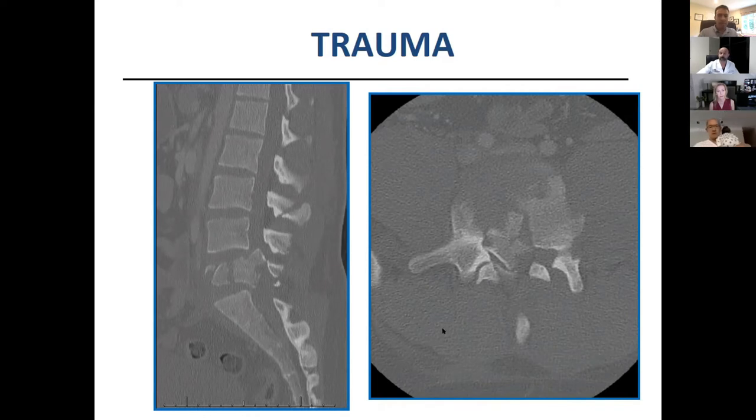So in the middle of the night, these sagittal split type fractures are unique in that they tend to require a corpectomy. They usually don't heal well on their own, unlike the oblique type fractures. So again, you're talking about a big surgery. If you're going to do it, you can do this all posteriorly. You can do a laminectomy, take out all those fragments, put a corpectomy cage in there, and then instrument him likely two up, two down, maybe even a little higher because of that fracture at L3. Maybe you go a couple levels higher than that.